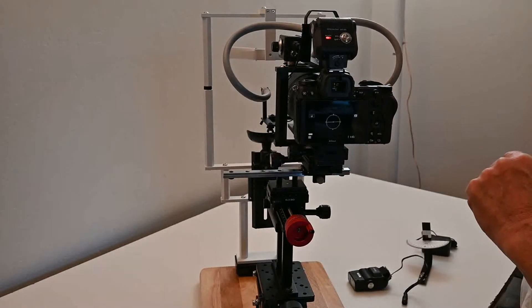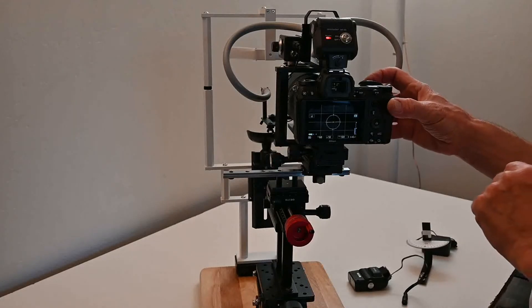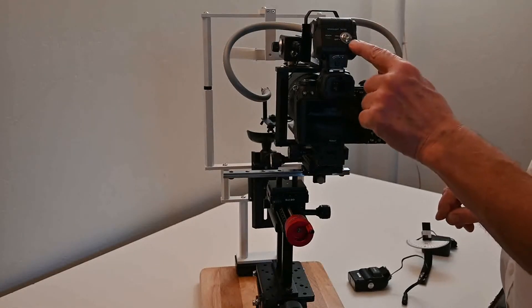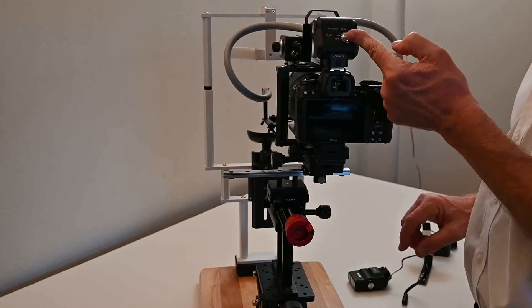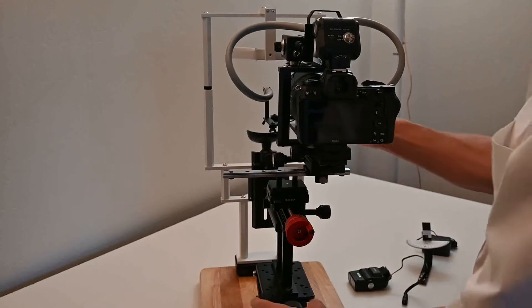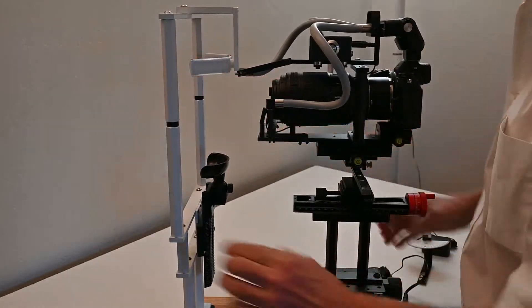This is the power switch for the camera, which you can turn on and view the picture on the screen. But first, proceed with the last step of setup: setting the light angles. Turn this around to get a good angle on that.